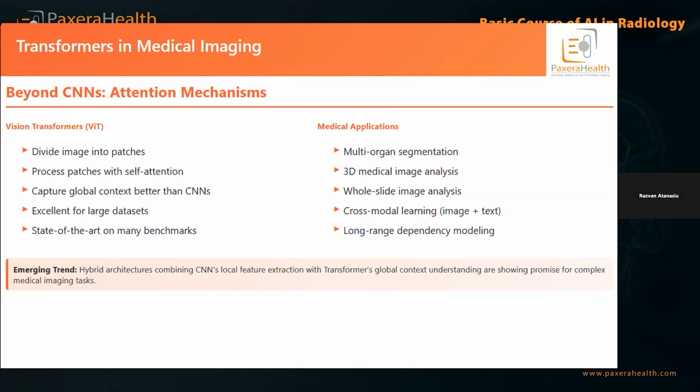Vision transformers are a little bit more involved, because they convert an image into a sequence of flat patch tokens by splitting the image into fixed-size, non-overlapping patches. I will stop here, because you can think of the patches as the word example from the beginning. So now you have these vision patches, segments of the image, and you get the same multi-head attention correlations that you would get with words in a sentence or a paragraph.